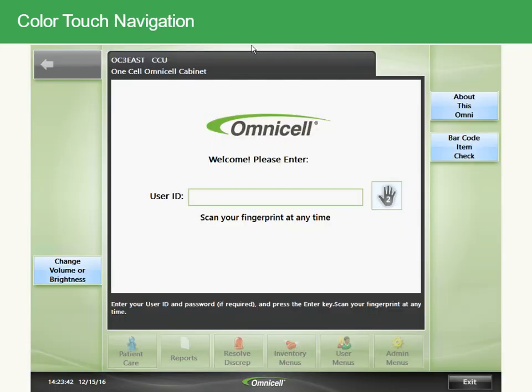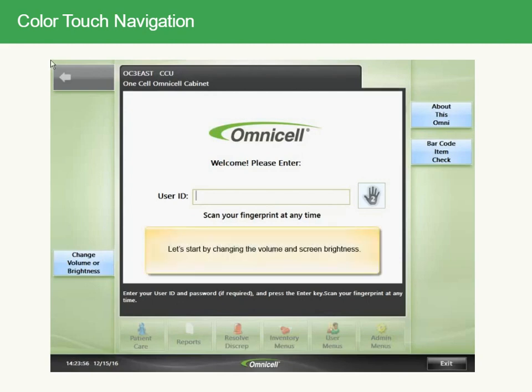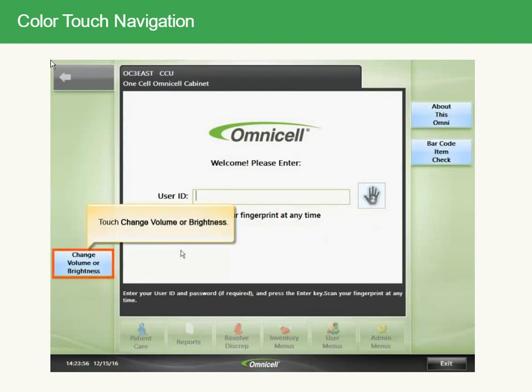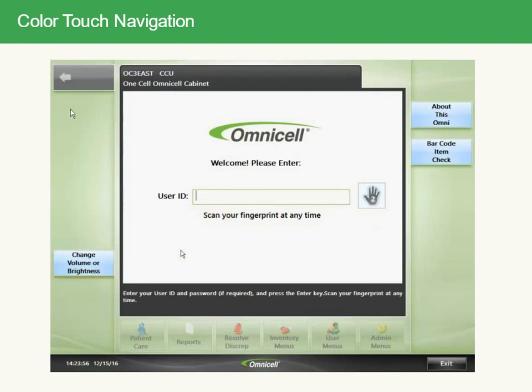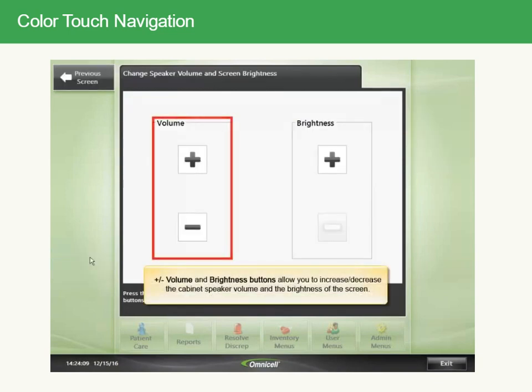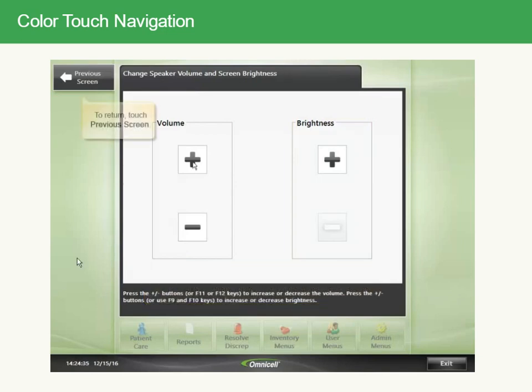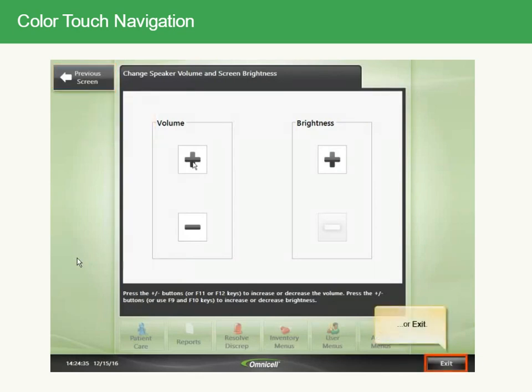There are many functions accessible to you from the login screen that you don't have to be logged on to access. To change the volume or screen brightness, touch Change Volume or Brightness. Plus or minus buttons allow you to increase or decrease the cabinet speaker volume and the brightness of the screen. To return, touch Previous Screen or Exit.